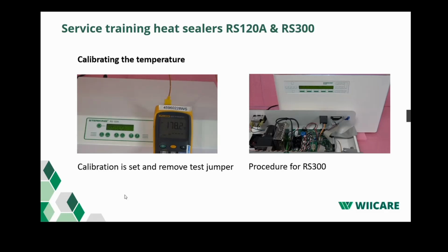If the temperature is the same, the sealer is properly calibrated. Make sure you remove the jumper before you reassemble the hood.